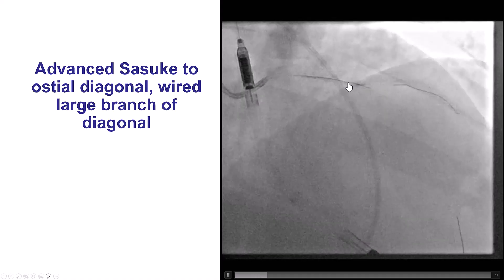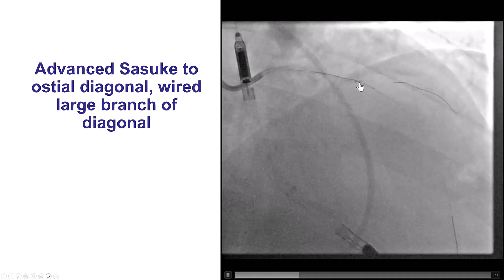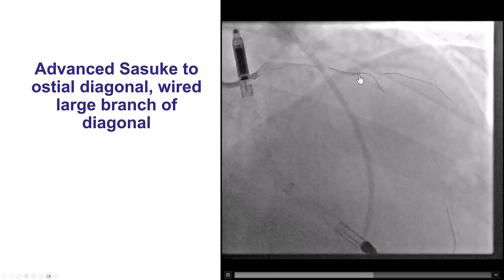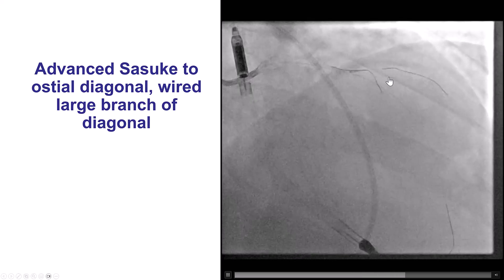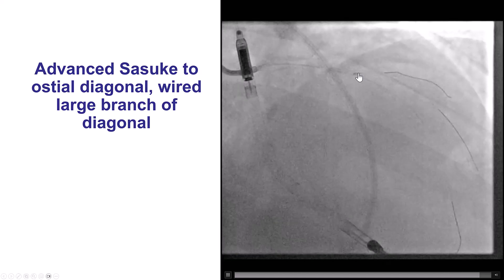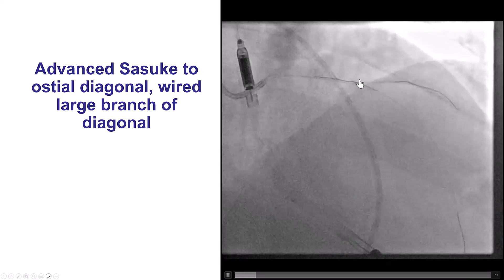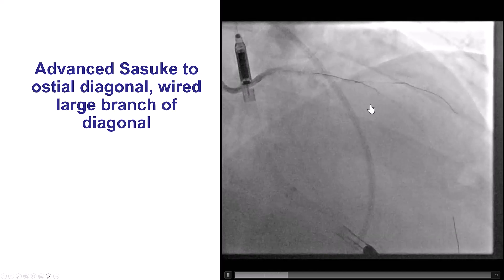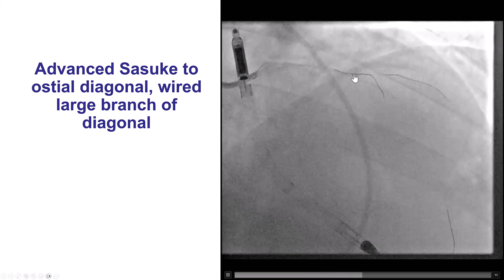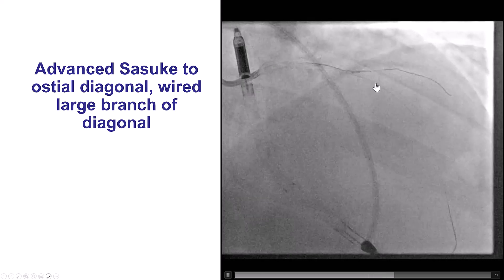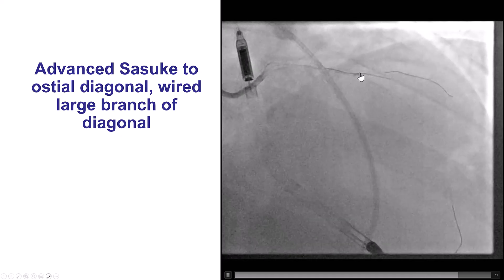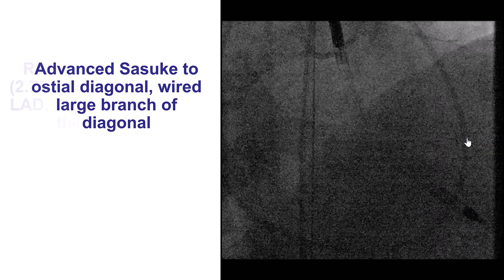We then took a Sasuke dual-lumen microcatheter and performed this maneuver done by two operators. The operator in the front is advancing the Sasuke a little bit further every time, while the operator in the back is probing with a guidewire — another cyan black guidewire. We change the position, and eventually the location of the dual-lumen becomes just right, and the guidewire enters into the desired branch. Two operators: one is probing with a polymer-jacketed guidewire gently, the other is moving the Sasuke dual-lumen microcatheter by a small amount. By probing back and forth and making small adjustments of the Sasuke position, eventually the cyan black goes into the desired branch.